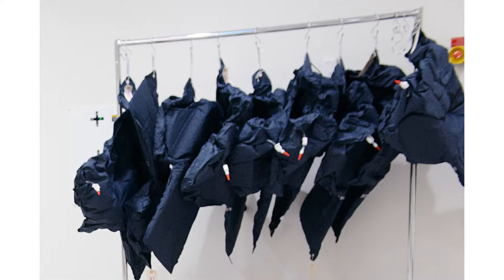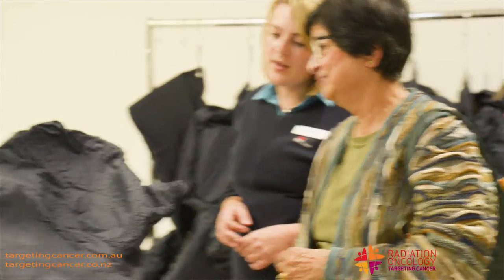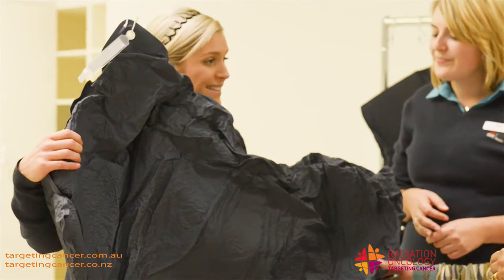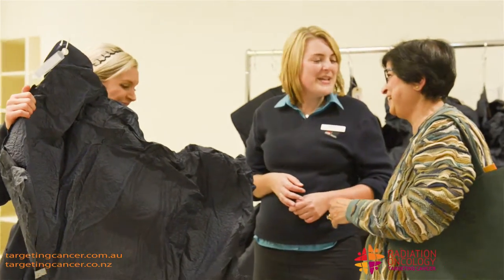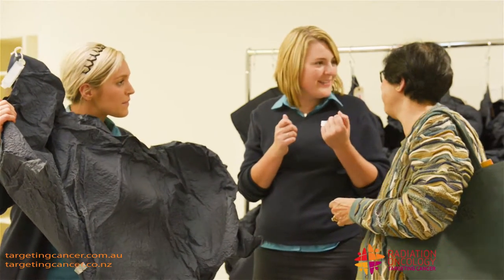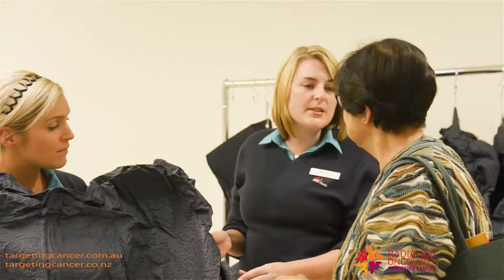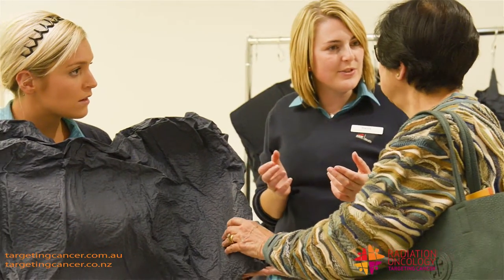You can see the patient's head goes up at the top here and these are supporting their arms, which are up above their head. That's the rest we use for breast and lung patients together. They start out soft but are actually quite comfortable because they're moulded and supported to each individual patient.